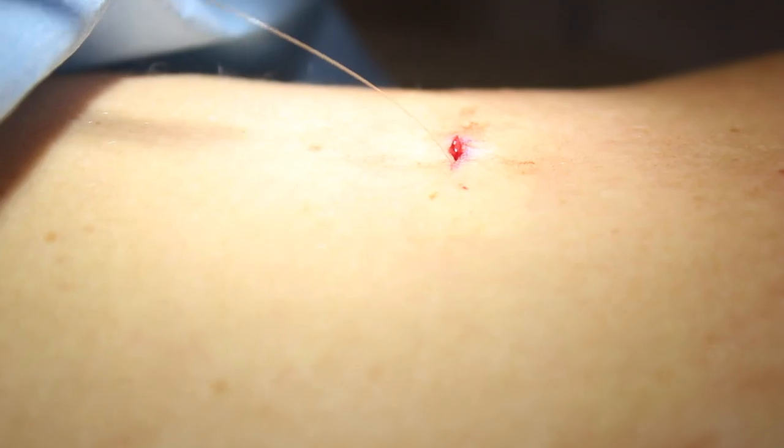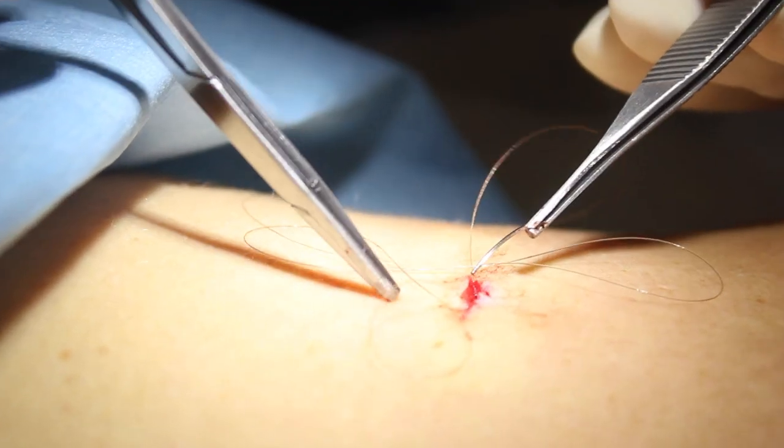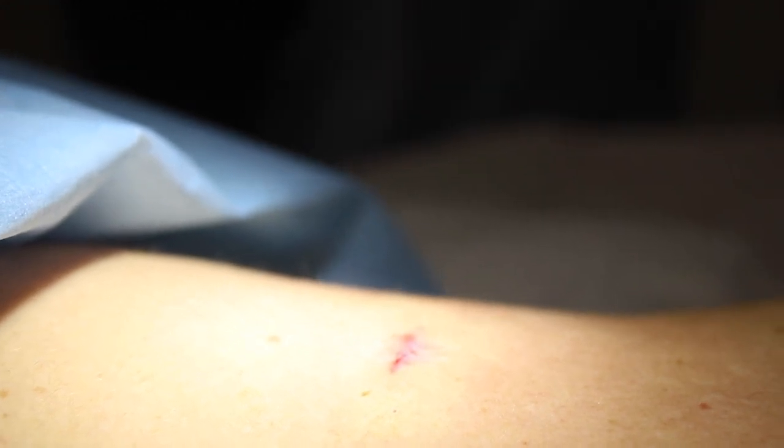I use dissolvable sutures here. This is a dissolvable suture going underneath the skin — the sutures are buried underneath the skin so you don't see them from the outside. This avoids that unsightly look of a classical scar with the little dots on either side.